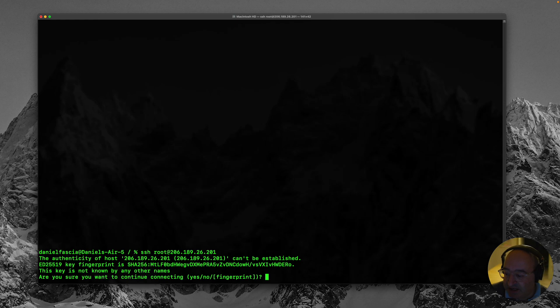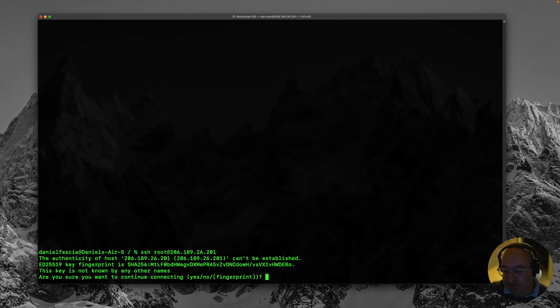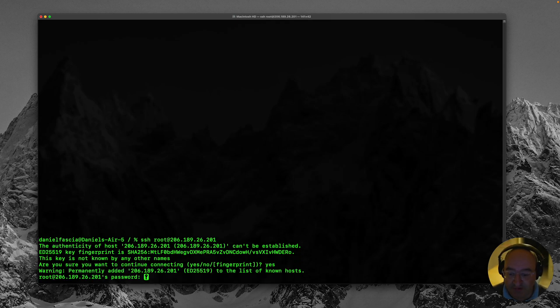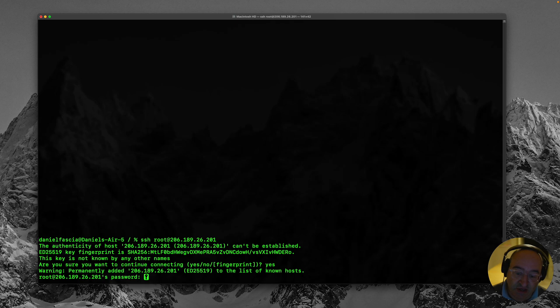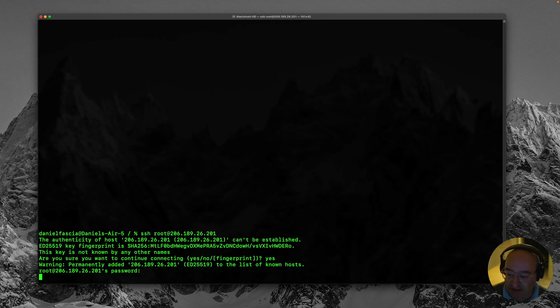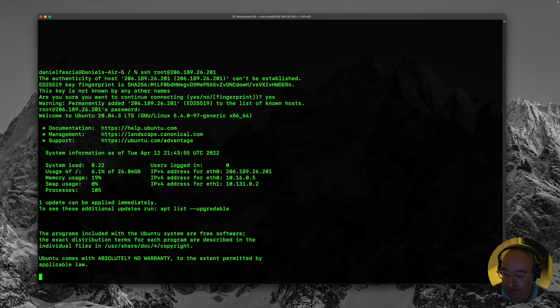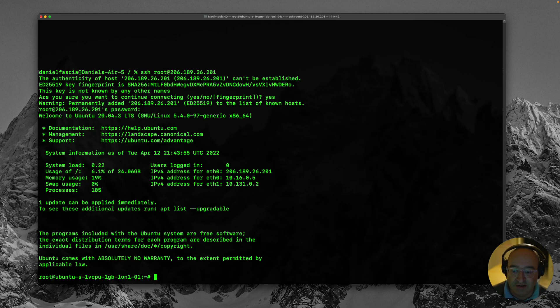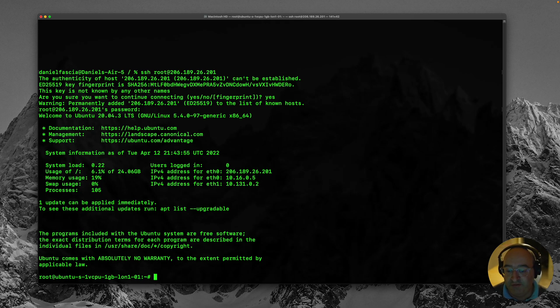We've never connected to this before so it's going to ask if we will accept this special key to approve the server. Say yes and now it's asking for the password and that's the one that we created. So I'm just going to type that in and hit enter and we will be logged in to our new remote server. Like magic we are now looking at the command prompt on the server which we have just set up and purchased.